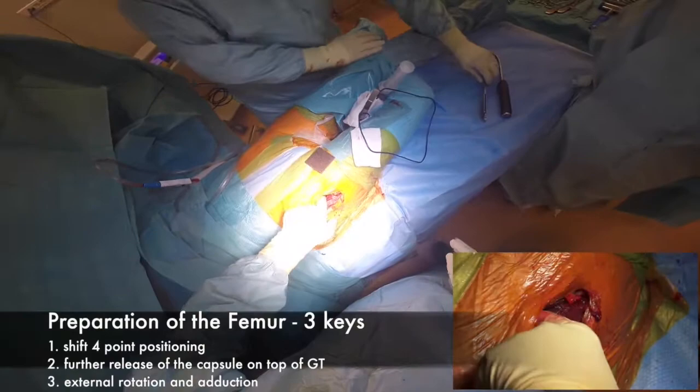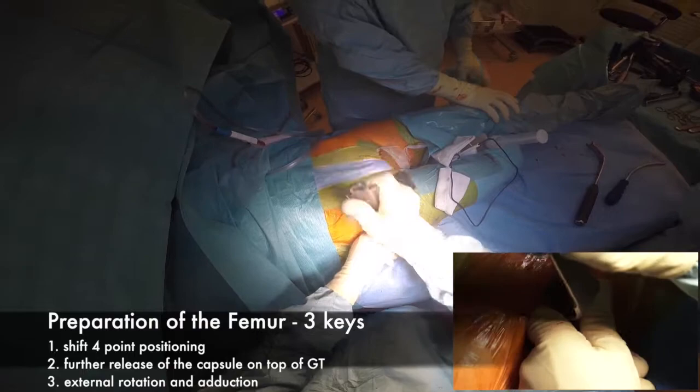1. Four-point positioning. 2. Further release of the capsule on top of the greater trochanter. 3. External rotation and adduction.